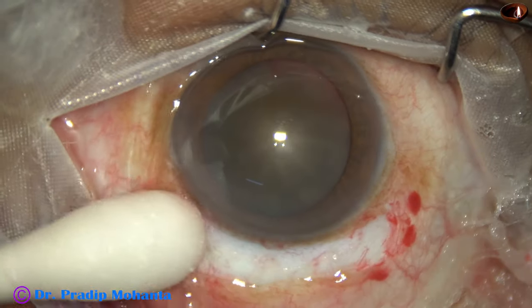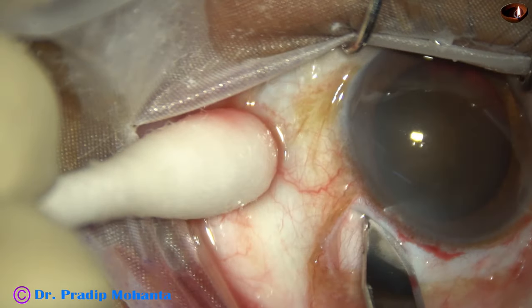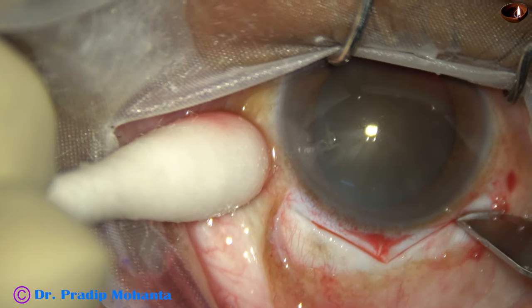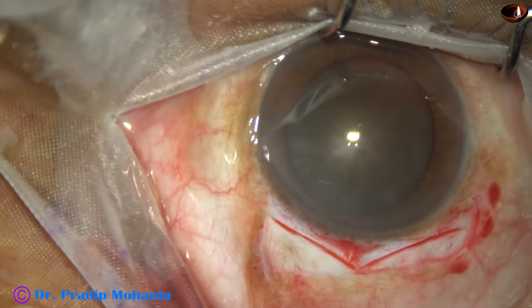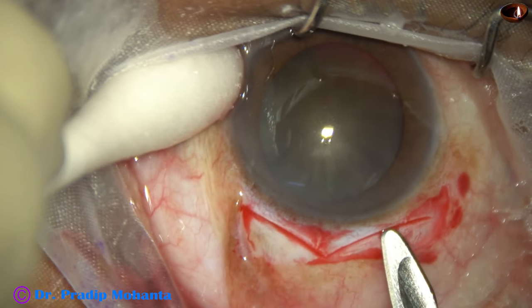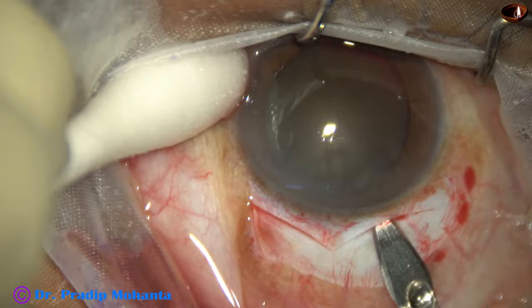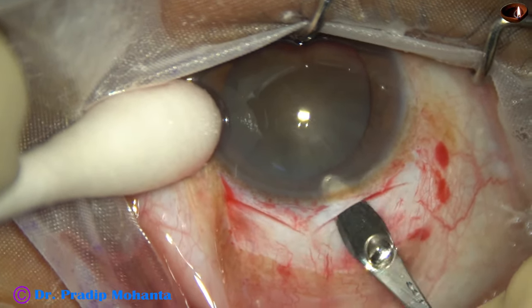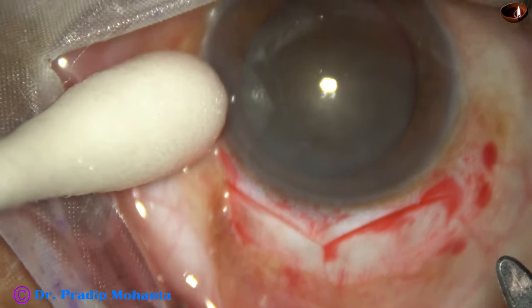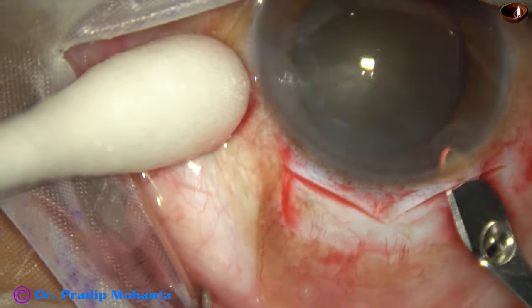A V-shaped incision is being made — this is one arm, this is another — just 1.5 millimeters away from the limbus. Now, as we do a sclerocorneal tunnel, in the same way the sclerocorneal tunnel is being done, sweeping backward and to both sides.